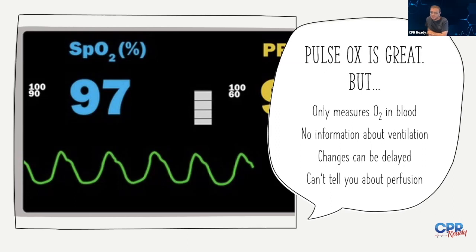Basically measures the oxygen on board of the blood cells.